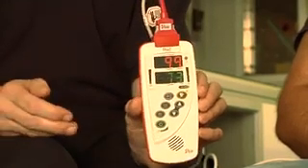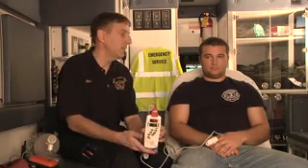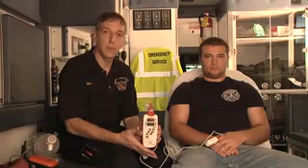If we decide that a patient's work of breathing is insufficient to sustain them, we'll begin ventilating with a bag valve mask. Now, one of the changes in the American Heart Association Guidelines 2010 has to do with the use of an airway in a patient. In a patient who's spontaneously breathing, there is not a great value in using an oral or a nasal airway unless you're having difficulty ventilating the patient.